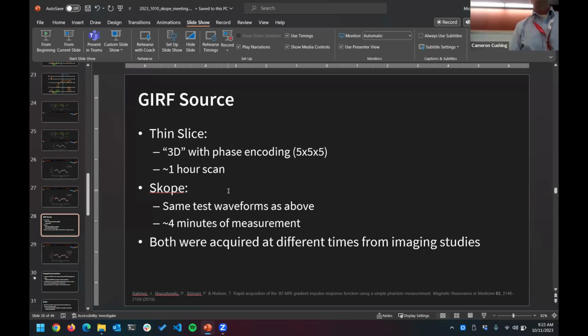Okay. I have one brief question, and it's leading because the group here will go this afternoon to the 10.5 and we'll do a demo showing how we acquire GIRFs. And one component is you've been talking quite a lot about self terms, like GX to GX. So what does GX do when you pulse it? But then there's also these cross terms, like what does GY do when you pulse GX? Has any of that come into your consciousness for this type of work as well?